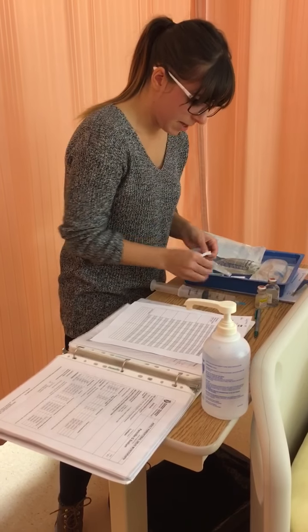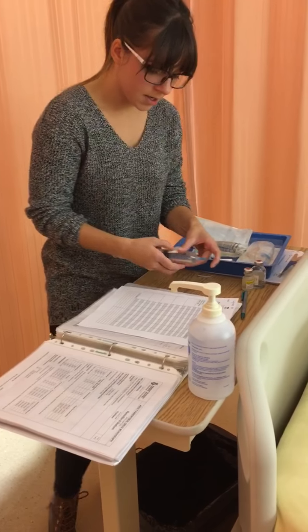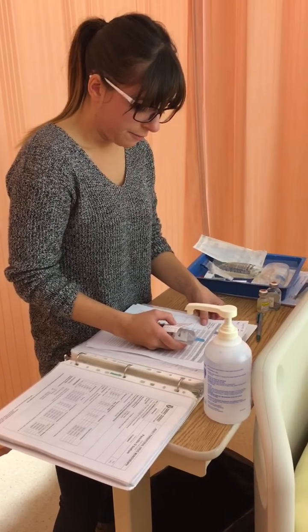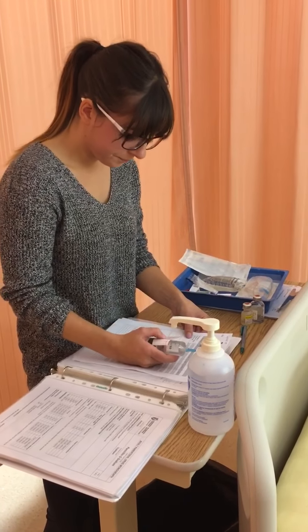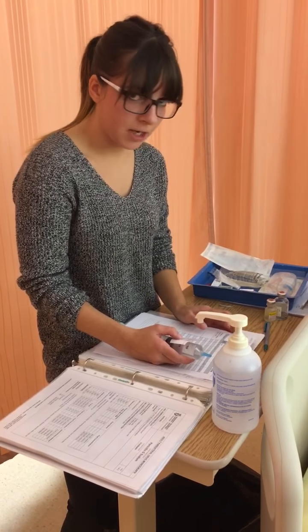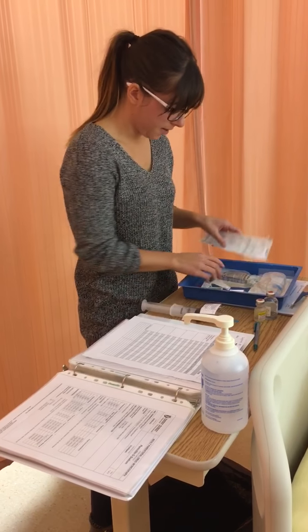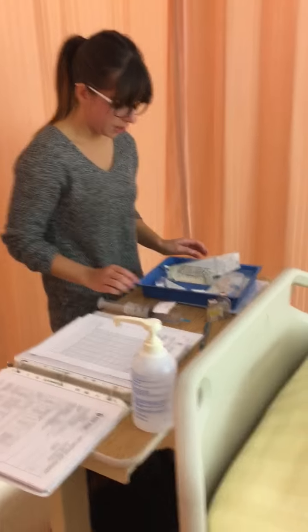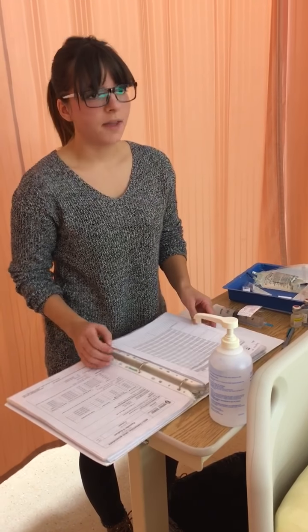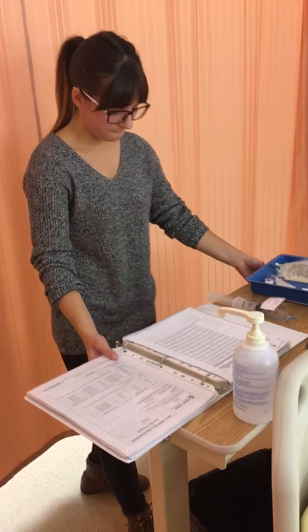So now I'm going to do my second med check. Okay, so we have the right drug, penicillin, right dose, our 40 milliliters that we're going to be infusing. Right route is IV. Right time is 11:30, and right patient is Pablo Pitts. Okay, so we have the correct dose, we have the correct med. So I'm now going to enter the patient's room, remembering that the patient always has the right to refuse the med, so I have to keep that in mind. Okay.